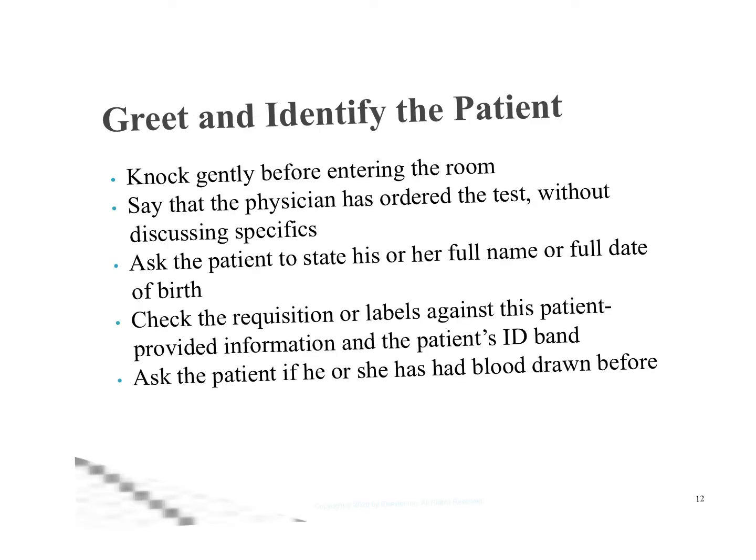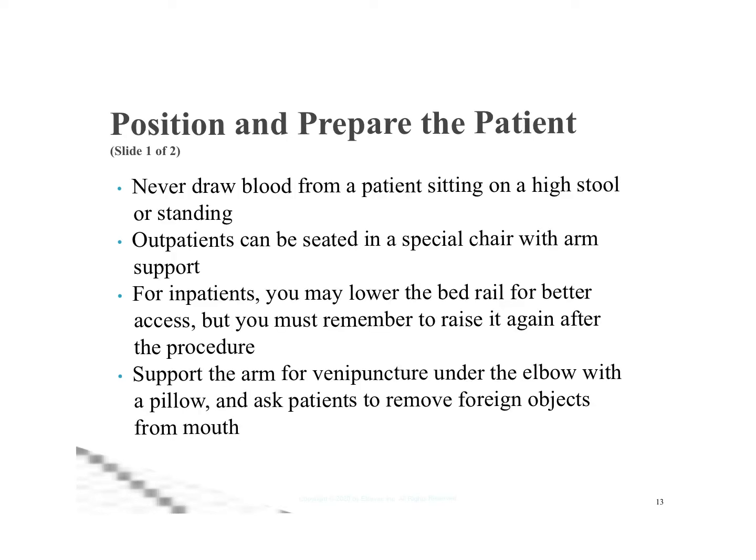We need to make sure we greet and identify our patients as well. Knock gently before entering the room. Don't just barge in. Say that the physician ordered the test without discussing really any of the specifics. Again, we're going to ask the patient to state his or her full name and full date of birth. Check the requisition or the labels against the information the patient provided and the patient's ID band, and then ask the patient if he or she has had their blood drawn before.